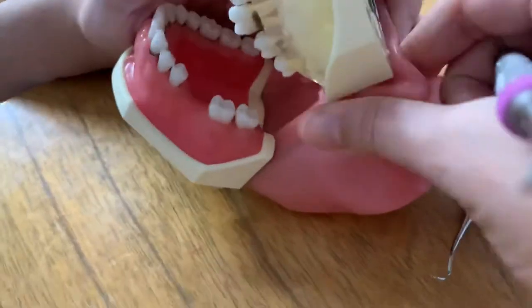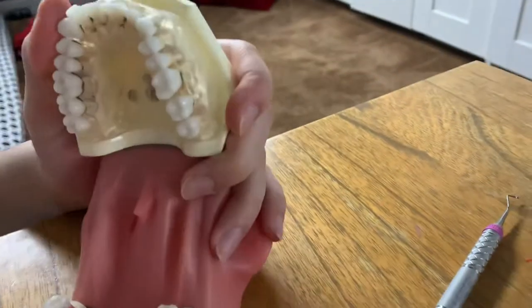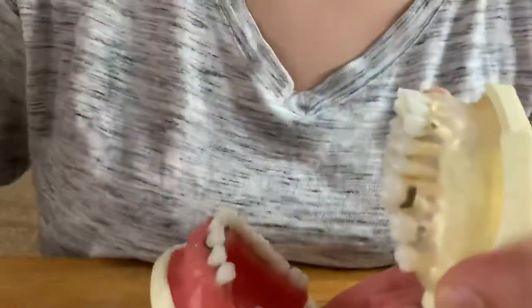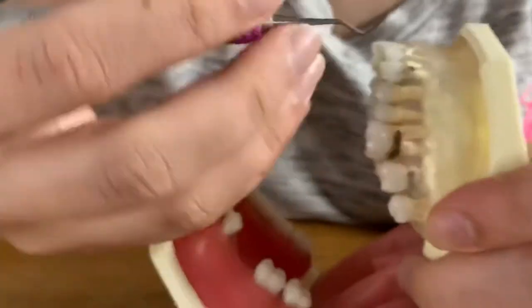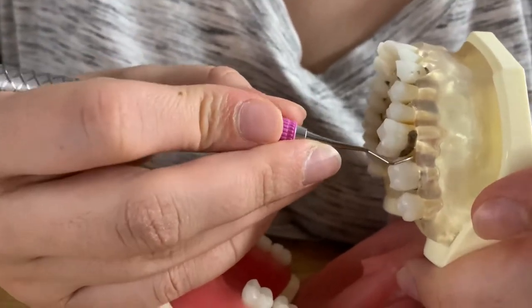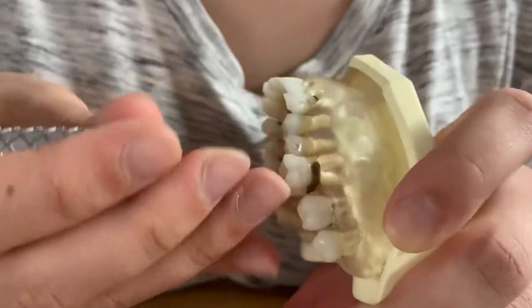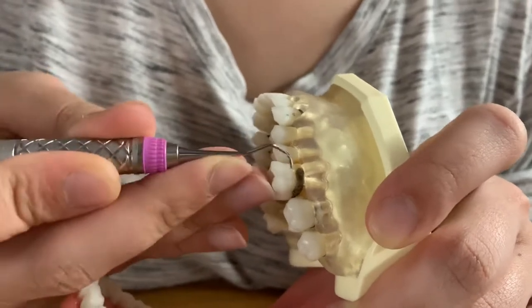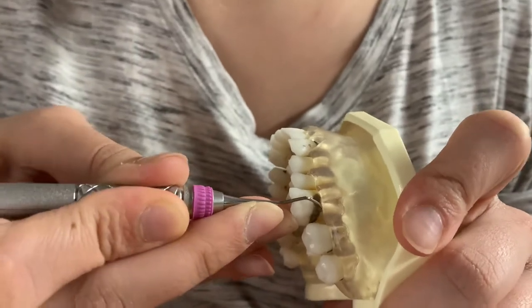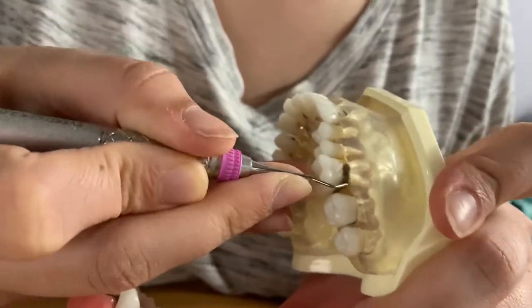I'm also going to do the same thing for the left side. We're going to do the same thing over here: V to the D. I'm going to start over here at the distal line angle, fulcrum. I usually like to fulcrum on the opposite side of whichever surface I'm working on for the posteriors. I'm going to go in using the toe third, rock and roll, and end up interproximally.